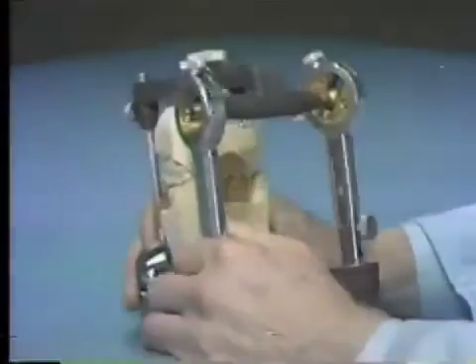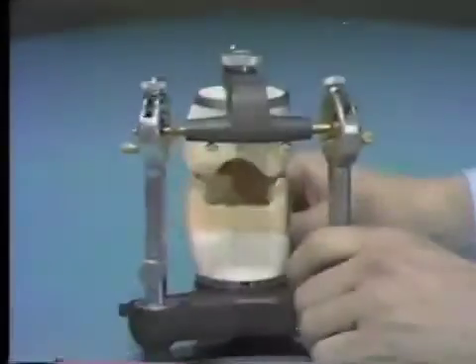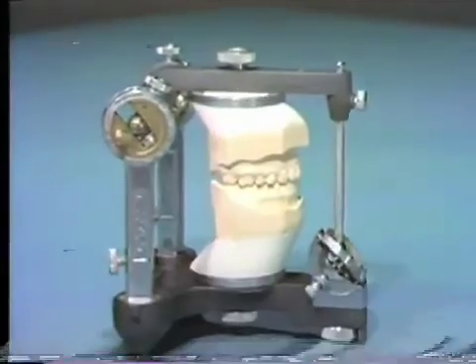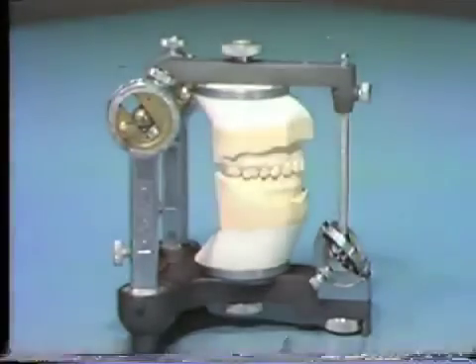The analysis of the articulated casts familiarizes the dentist with the occlusion prior to dental treatment. Whether the problem requires correction via orthodontics, prosthodontics, periodontics, oral surgery, occlusal splint therapy, or occlusal adjustment.